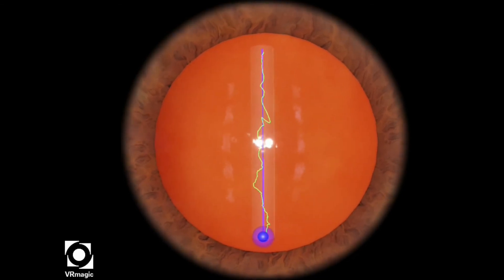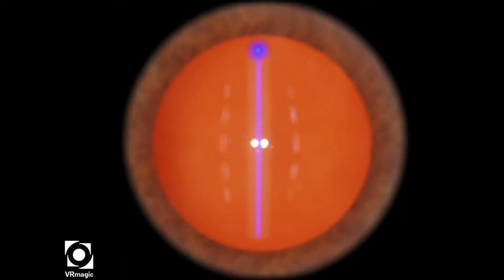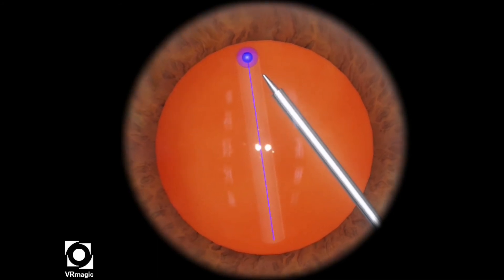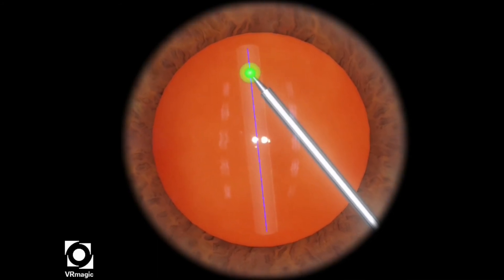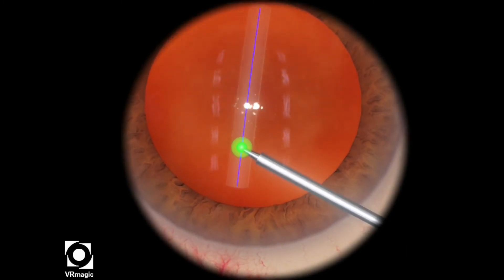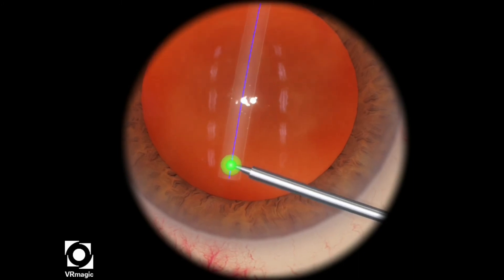And there you go. That green line is the tracing of where the tip traveled. It'll be ideal if you can make that as straight as possible. Here we go again, just tracing as straight a path as you can, right until the end.